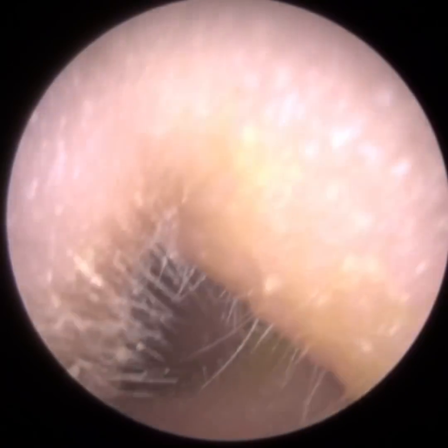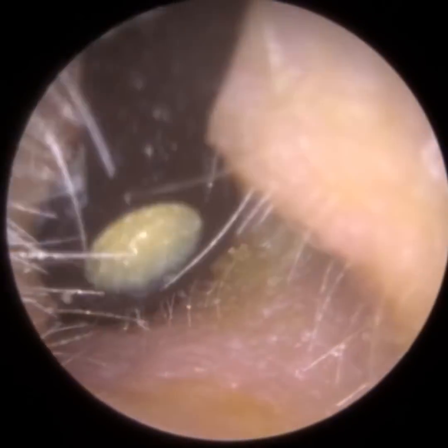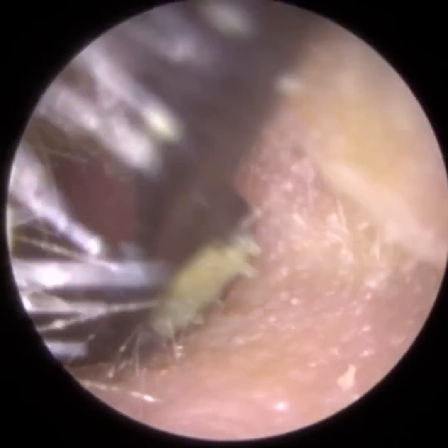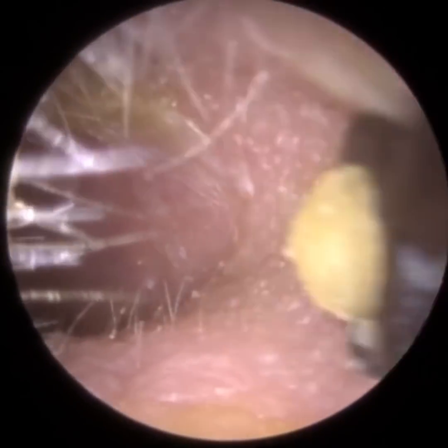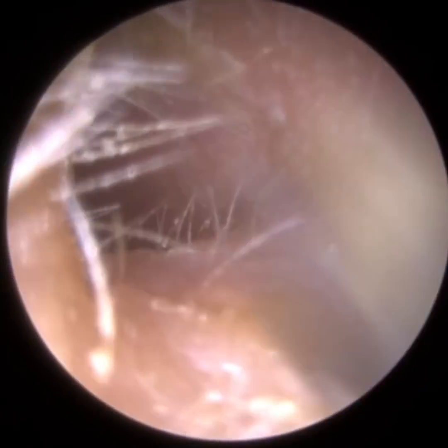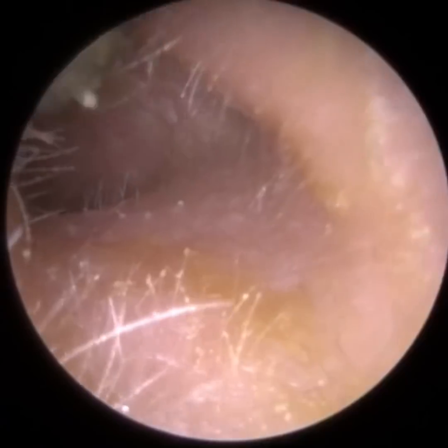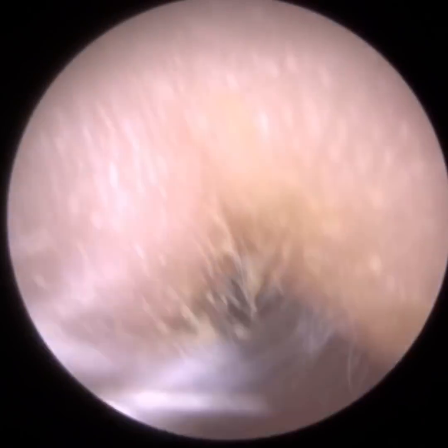Whereas the outer third, where we are now, there's a thicker layer of skin, about a millimetre in thickness. There's cartilage there, so there's a bit of a buffer. Cartilage is a bit more flexible than bone. And see, I'm just using this Jobson horn. It has other names. It's most typically called an ear curette.